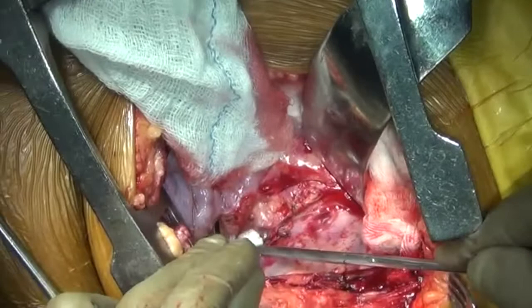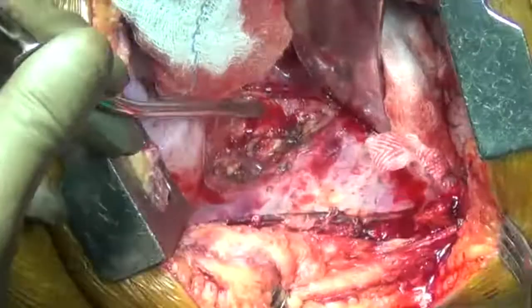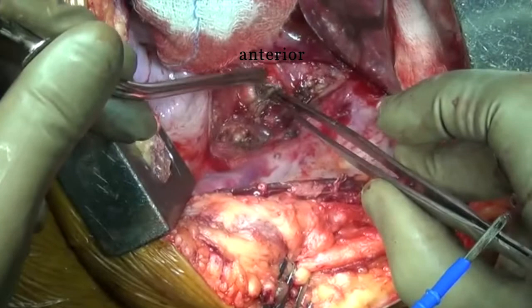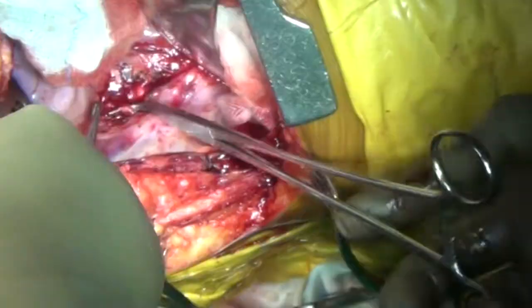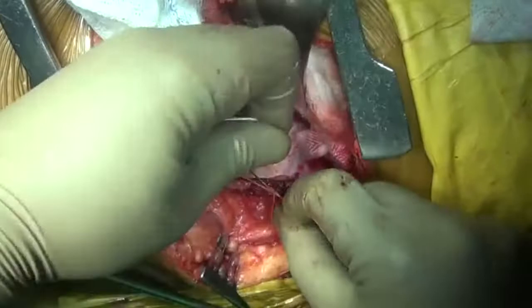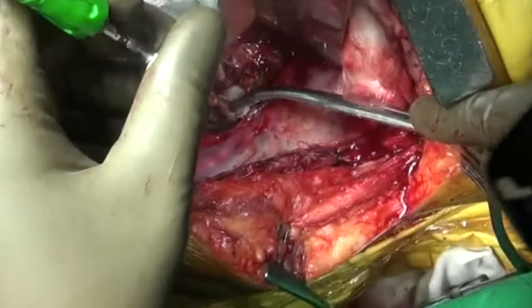The intercostal vessel just beneath the crus of the diaphragm at D12-D11 is quite large and can be missed easily. Meticulous dissection and exposure of this vessel is important — if you damage it and it starts bleeding, it is very difficult to control because the crus of the diaphragm limits access. Exposure of the anterior margin of the psoas is extremely important to avoid going into the substance of the psoas and damaging the nerve roots. After identifying the intercostal vessels, they are ligated, clipped, or cauterized depending on preference, ensuring the anterior clip or tie is at least one centimeter away from the junction of the intercostal vessel with the aorta.